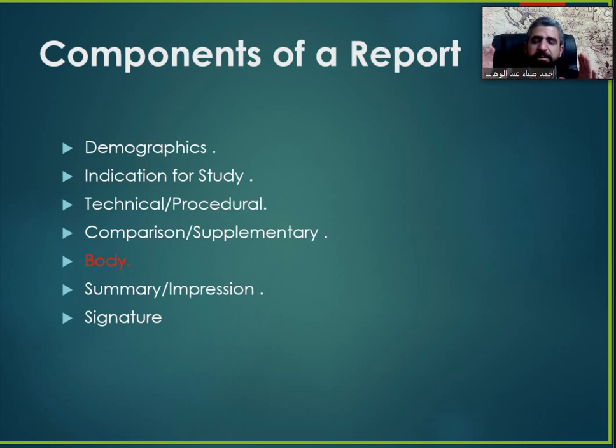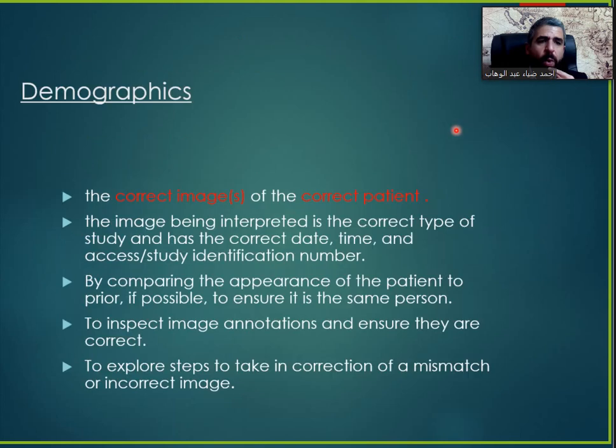Each report should have the following components. First, the demographics, the indication of the study, the technical or procedural explanation, comparison or supplementary documents, the body of the report, the summary or the impression, and the signature of the radiologist. We will talk about them one by one.